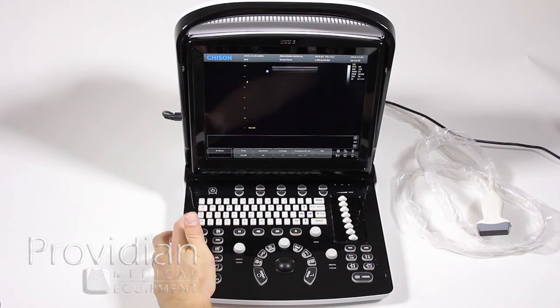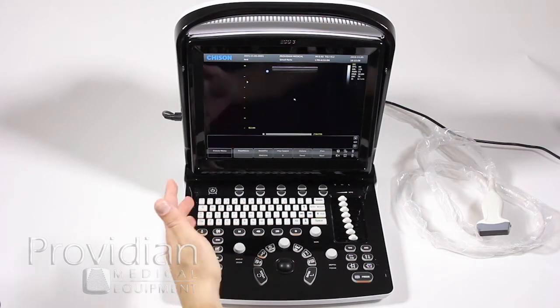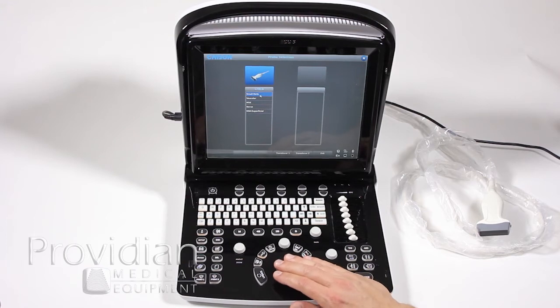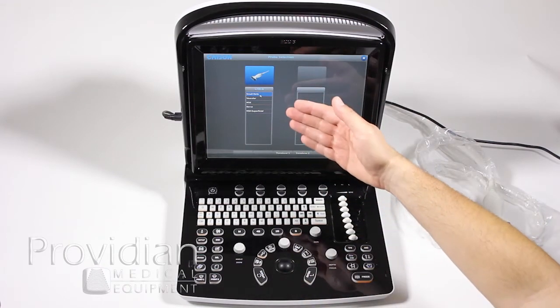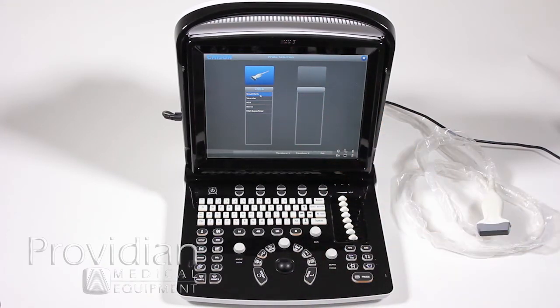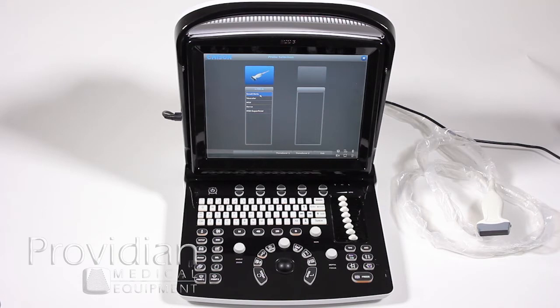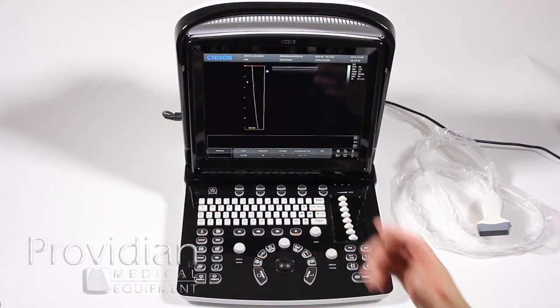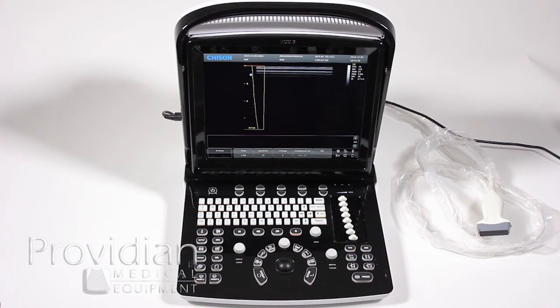The next thing you'll want to do is select your probe and the imaging preset. These imaging presets are designed to optimize the image for whatever specialty you're working in. They also assign things like your annotation library, body marker library, and calculations, so you don't have to go through a library and select each time. We'll go ahead and choose MSK, and you're ready to scan.